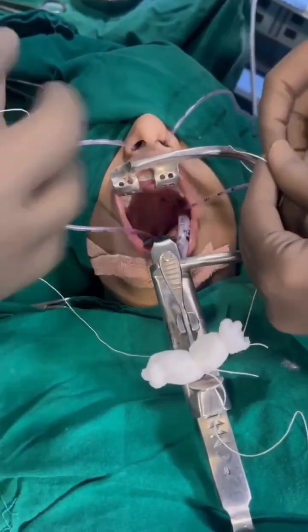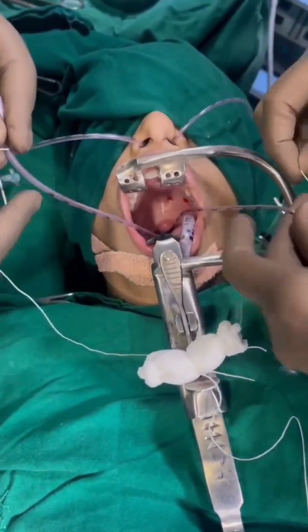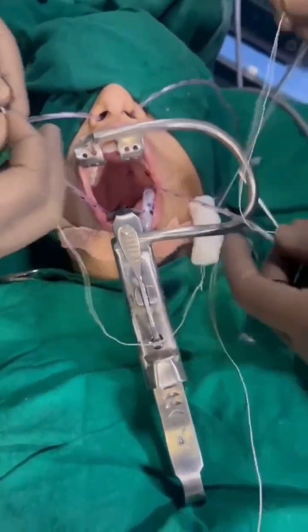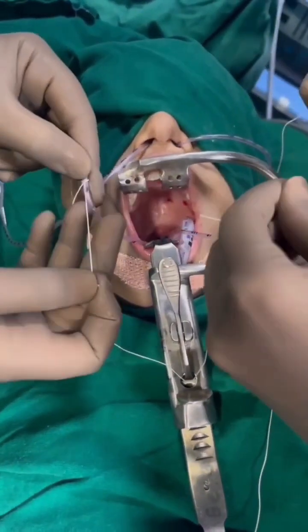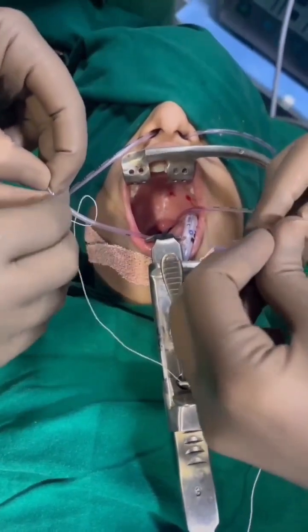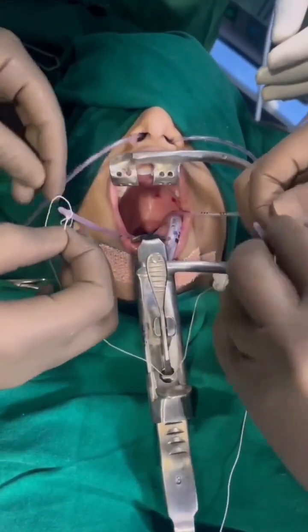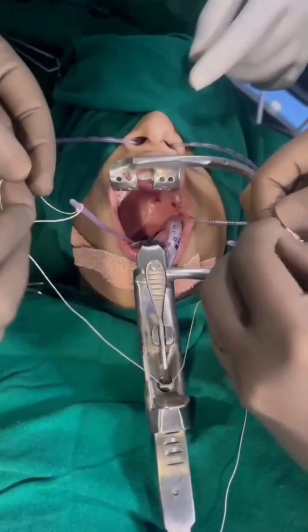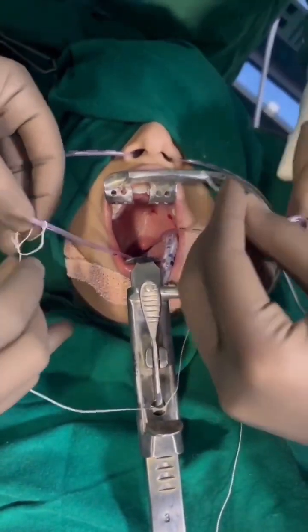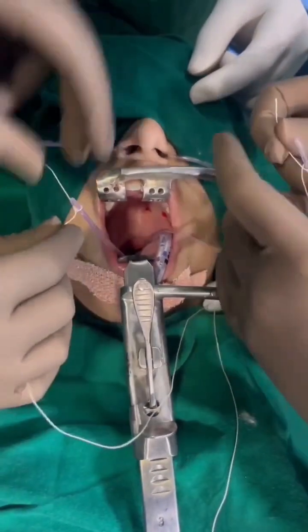On one side we tie one thread and on the other infant feeding tube we tie the other thread tightly, and the single thread is kept outside. We tie it in a tight fashion so that when we pull it, it should not come out. We can even use a Foley's catheter for this, but infant feeding tube is preferred because yellow is seen better than white when there is active bleeding.